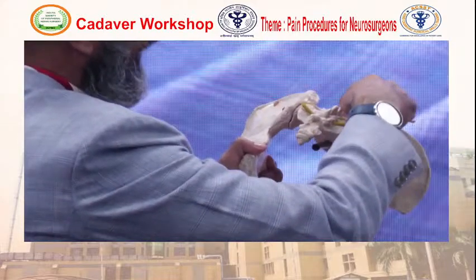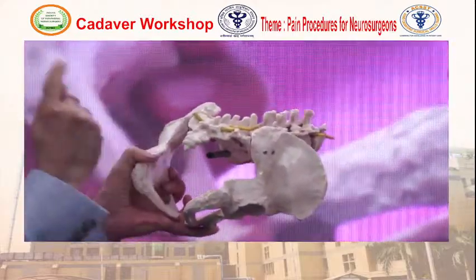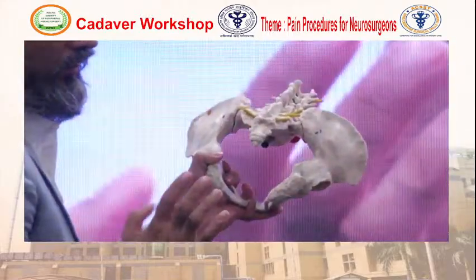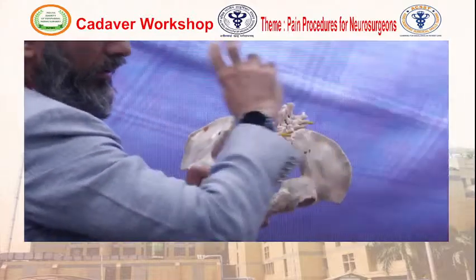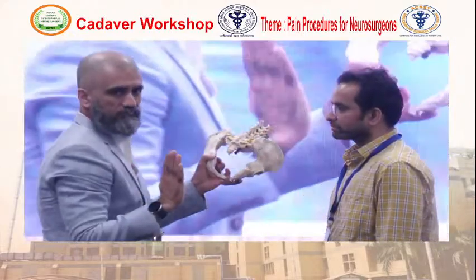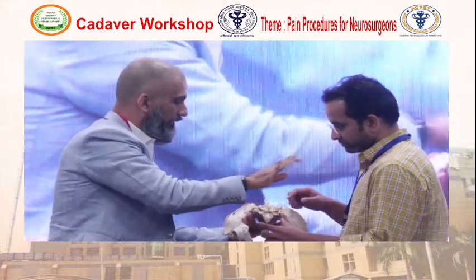So if this is the foramen, this is the eye, and the eye for fluoroscopy is the eye. So the eye has to be in the direction of the foramen. So if our target is this, this has to be the direction. So how do we achieve it? AP, then oblique, then this. If we are not getting a crisp image, we make it flat or cephalad. Clear?